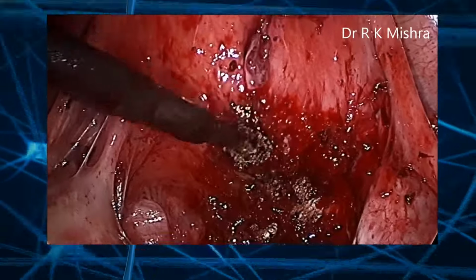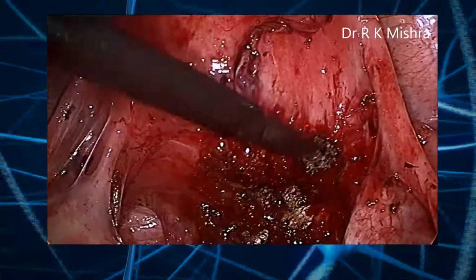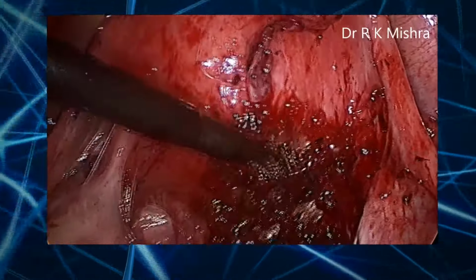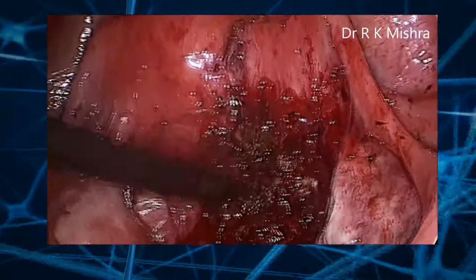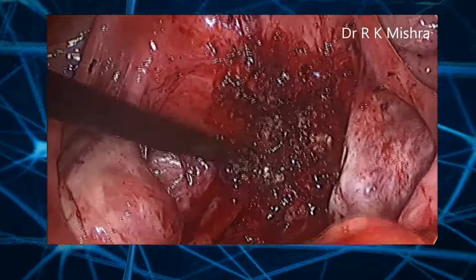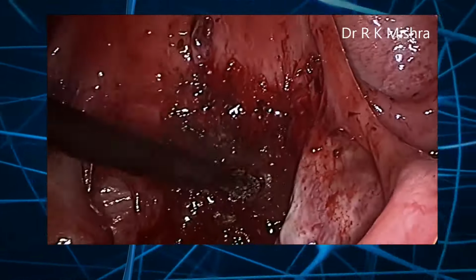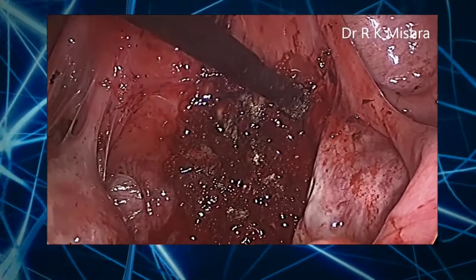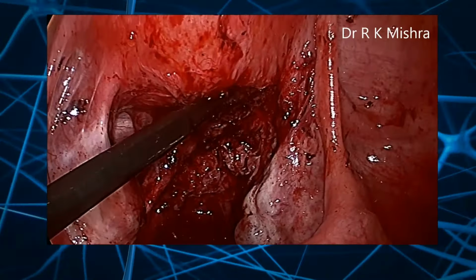Ureter, if you want to become sure, you have to do cystoscopy, but generally most of the time the color of the urine which is coming out from the Foley's is one important sign, and another is that you should remain towards the ovarian side, you should not strip it. Generally tearing the ureter is difficult in adhesion. If you are doing complete aggressive deep digging the ovary out, then the ureter will be damaged. If you keep yourself towards the ovarian side, then it will not be damaged.